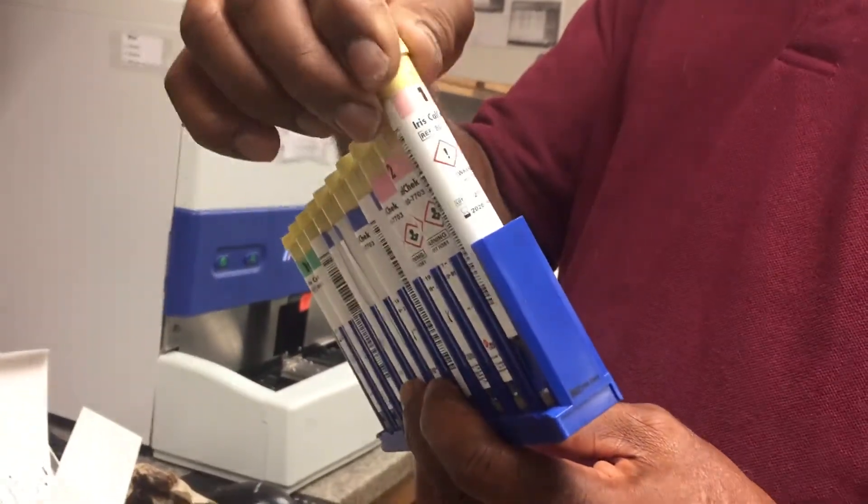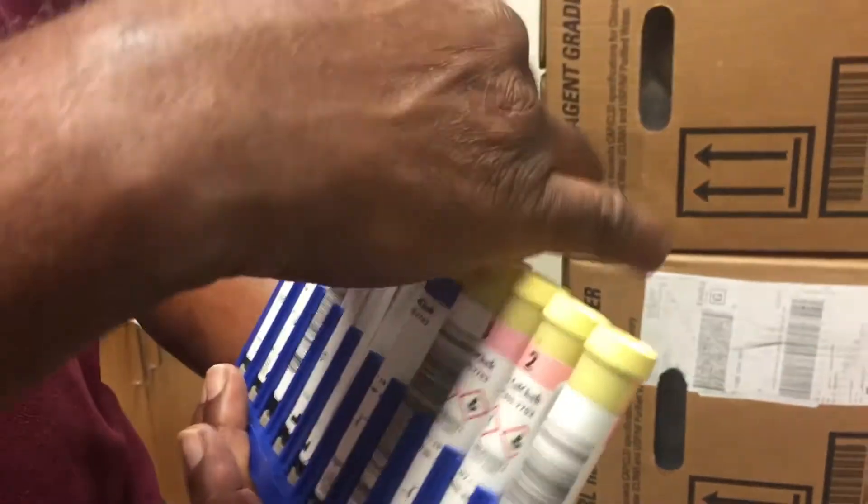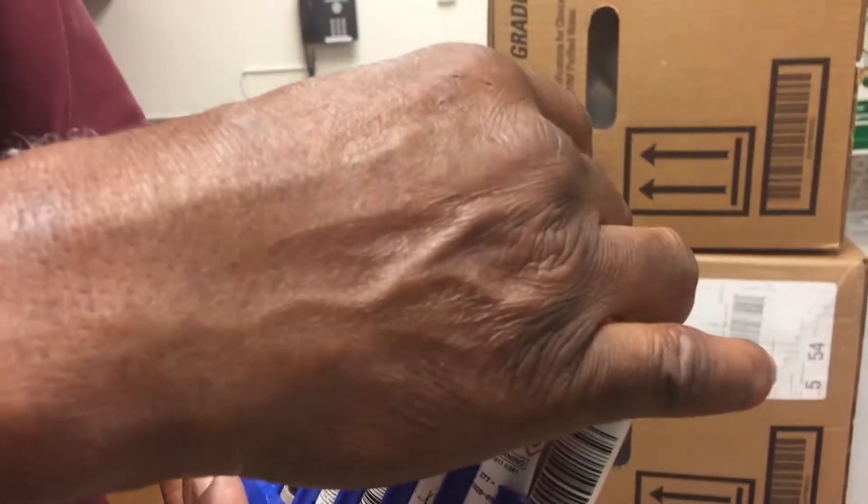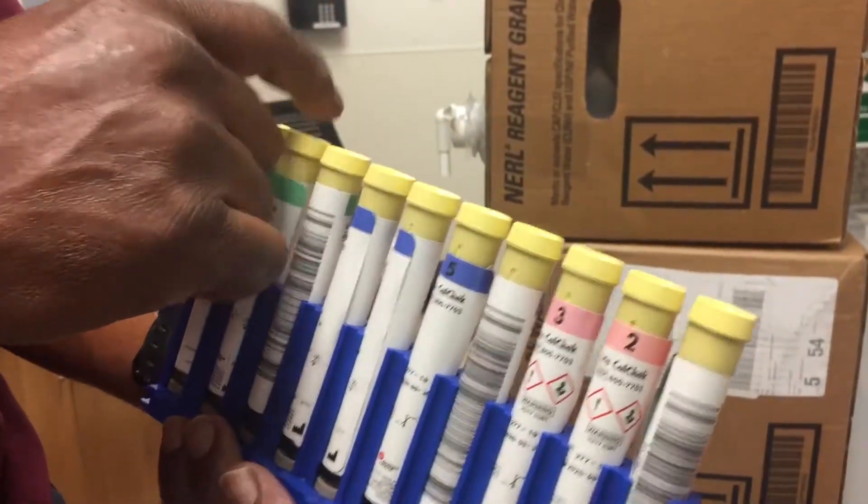So why do some of them have barcodes? Some have barcodes and some are blank. You've got to have them in order — one through ten.